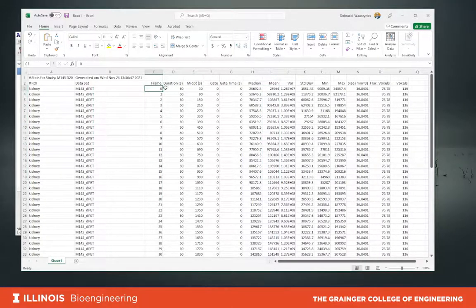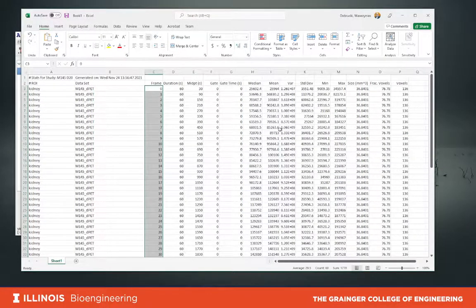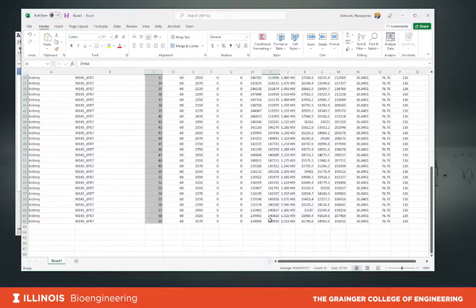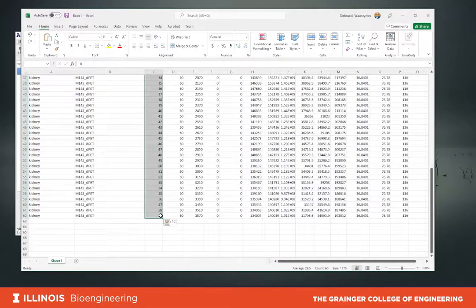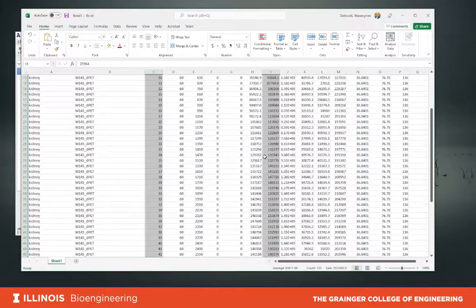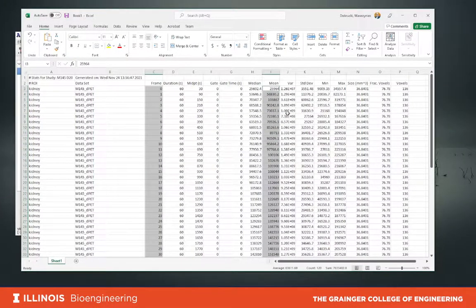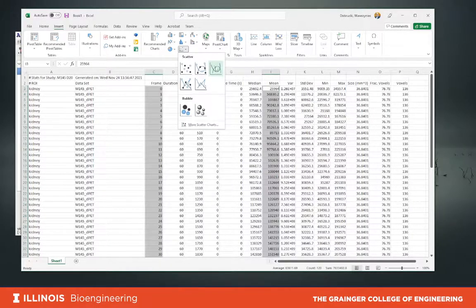This is the frame number — the number of minutes after injection — and the mean value. What we need to plot is the mean value versus frame. Let me select the frame column with Shift+click, then with Control select the mean value column and select the whole range. Now we have selected two columns: frame and mean value. Now we insert a chart — in this case it will be a scatter plot, X versus Y, with connected data points.